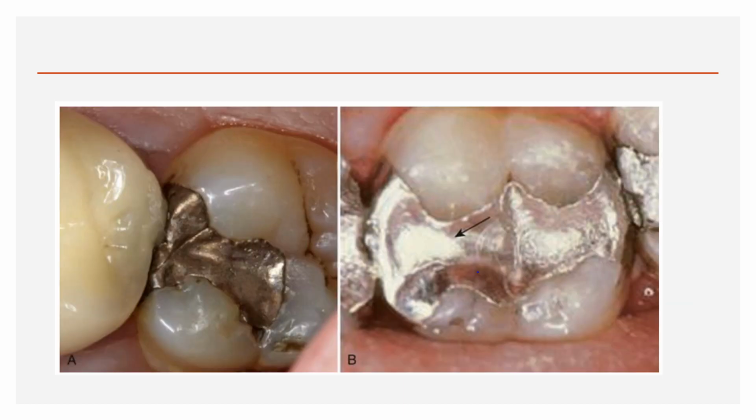In the first picture, you can see the line across the occlusal surface of an amalgam restoration that indicates fracture of the restoration, so that has to be replaced. The contouring is also not good, because an amalgam restoration should replicate the normal anatomic contours of the tooth. That might be one of the reasons it fractured. In the second restoration, the arrow indicates two restorations placed at separate appointments. That is fine, it might be a repair, but again the contours should be replicated properly.